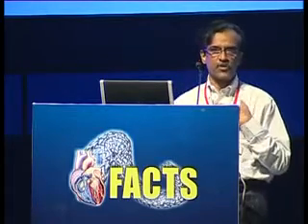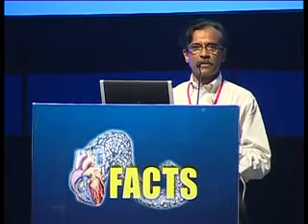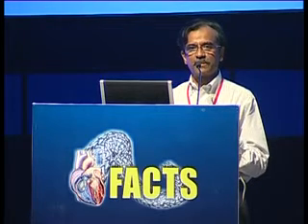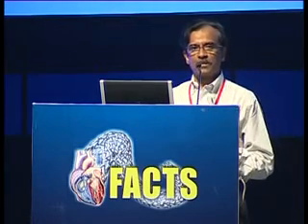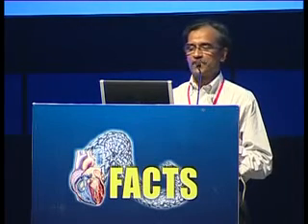If you force the catheter, mind you, you can deflect the interatrial septum and cause pain and discomfort in the chest. And sometimes forcing the catheter can cause a stretch on the IVC and cause abdominal discomfort. Any amount of force here is likely to cause complications. Never force the catheter. Bring down the catheter and advance it with a clockwise torque and a screwdriver maneuver to overcome the septal resistance. It helps sometimes.